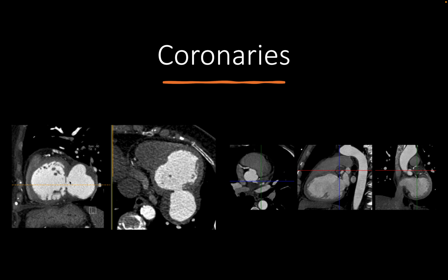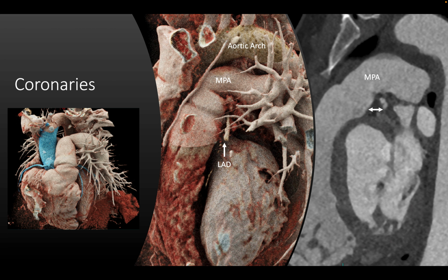It could tell us, of course, for surgical guidance, what the measurements of this aneurysm are, and a description of the neck of the aneurysm. Or sometimes the aneurysm is involving the coronary arteries themselves. So the follow-up of those aneurysms is crucial to understand: is there a trend of increase or not?